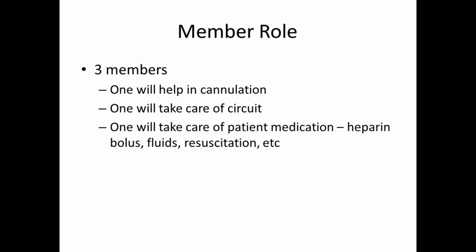You should have proper planning, and all the staff should know their job. While cannulating, you should not have to shout at them to give heparin. They should know that once the wire is going inside, they have to give heparin, and they have to be ready with all emergency medicines and everything.